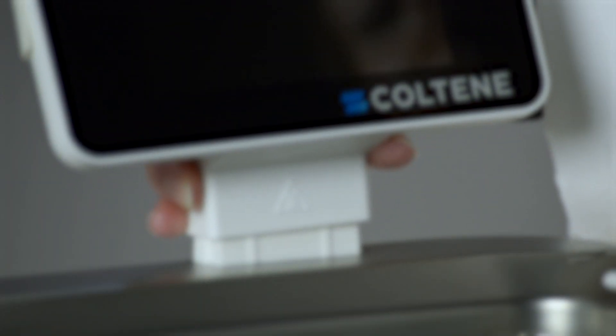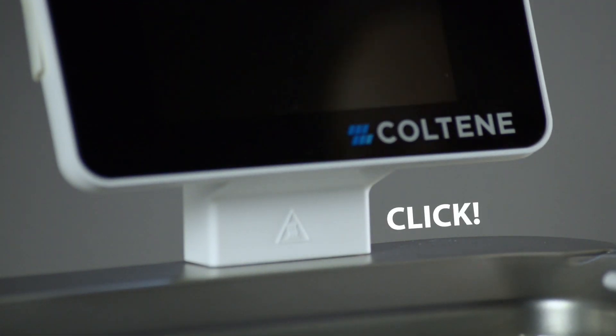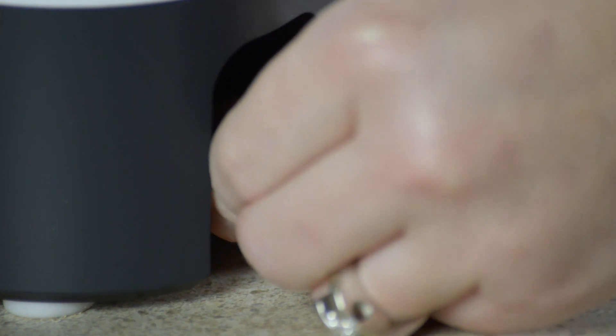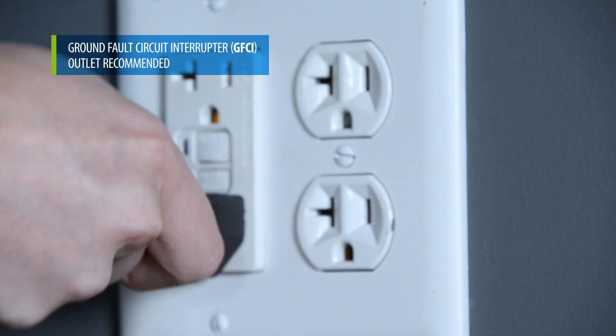Attach the connector on the bottom of the display screen module to the connector on the top right-hand corner of the unit until it snaps into position. Attach the electrical cord at the lower back of the unit and plug into a three-wire grounded AC outlet.